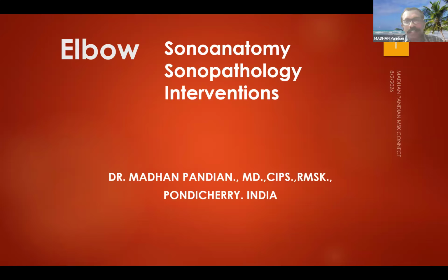I have designed my lecture focusing only on the elbow. I have deliberately avoided wrist and shoulder interventions. I think most of you would have heard from me. Such a very small topic seemingly, but needs a lot of discussion. You would be wondering, I'm going to take an entire session on the elbow, which contains some 76 slides, right? So we'll just quickly go through all the things.